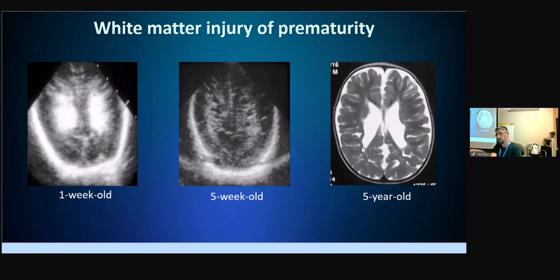So here you can see that there is no white matter. The ventricle is abutting the cortex. So that's why the ventricles are dilated, posteriorly dominant, and we can see this typical indentation over the ventricle because of the indentation of the cortex onto it.